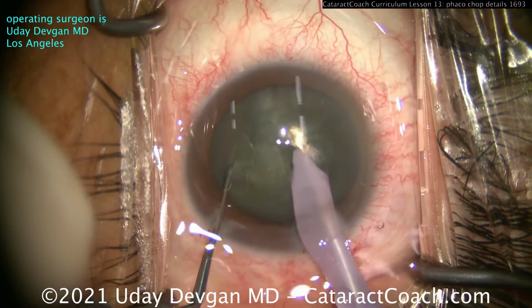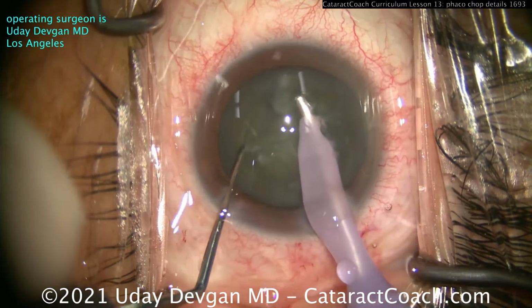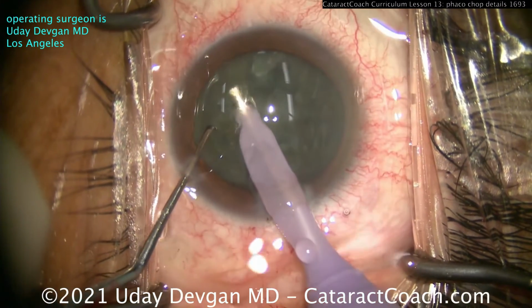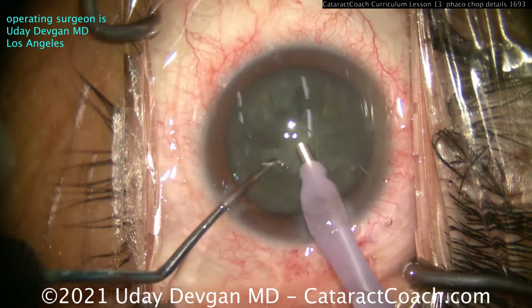They don't really chop. Now be very careful on a soft lens. When you go in there, if you go in with high vacuum, with high Phaco power, you can buzz right through the nucleus and boom, hit the posterior capsule. You obviously don't want to do that. So what are we doing now?